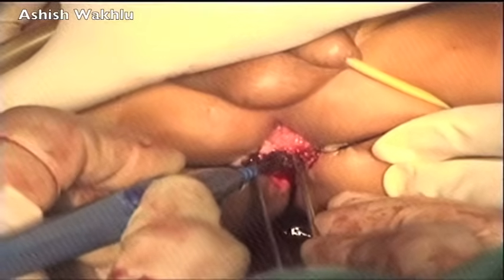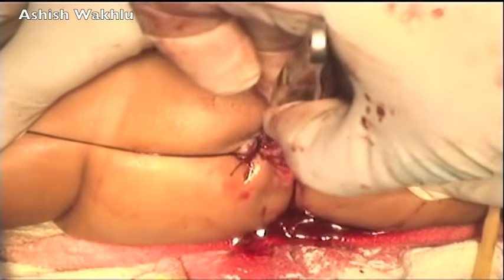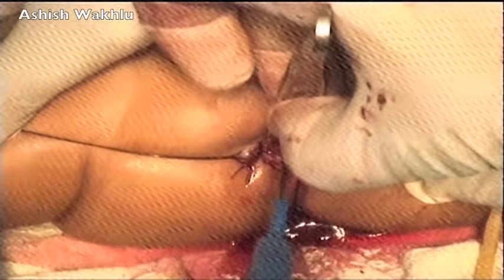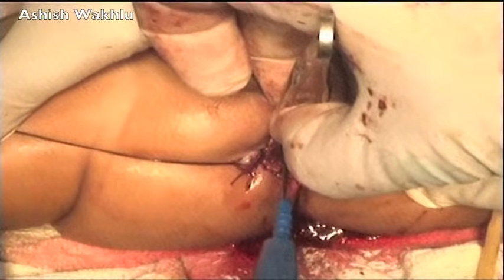Here we have divided the fistula in the posterior midline to enlarge the opening a little because there was a discrepancy between the narrow opening of the fistula and the size of the anoplasty incision.